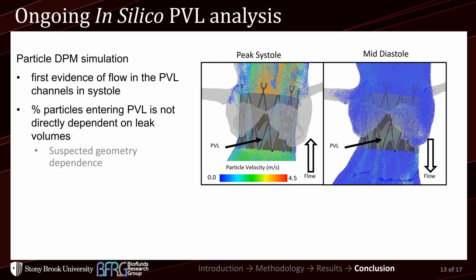into the systolic flow. The number of particles appears to not be dependent on the leak flow and highly dependent on the actual jet velocity, with the more stenotic valves causing more platelets to jettison downstream, down to the descending aorta, as opposed to remaining in the ascending aorta and native sinuses to then wash through the PVL flows.